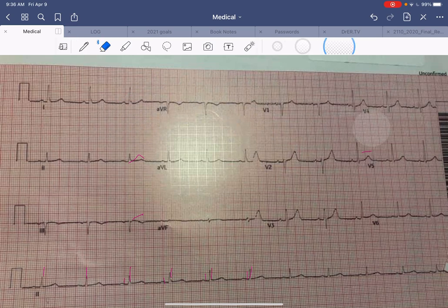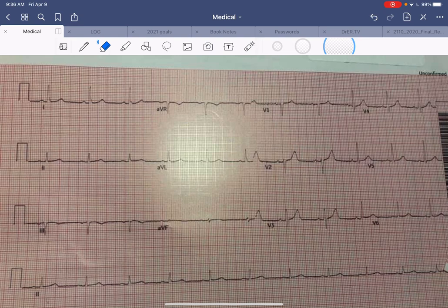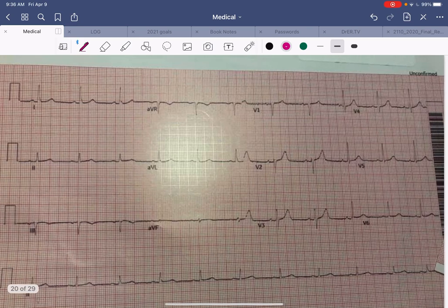I don't see any ST elevations, I don't see any major depressions — it's pretty much a normal EKG. But this patient had a significant story consistent with cardiac pain: pressure, tightness, and some sweatiness. He had cardiac risk factors like diabetes, hypertension, and high cholesterol, and kept having persistent chest pain, so a second EKG was done while he was in the emergency department.